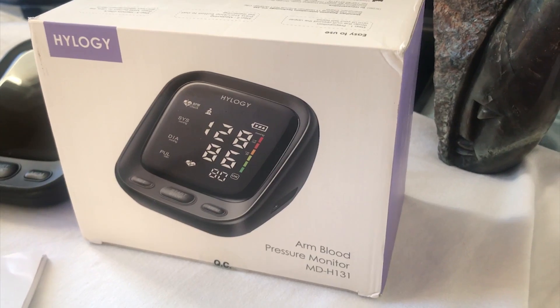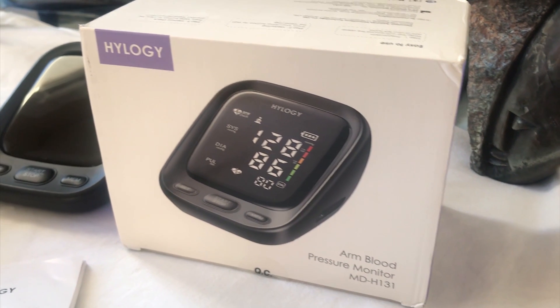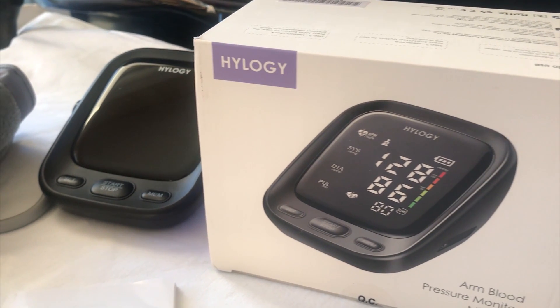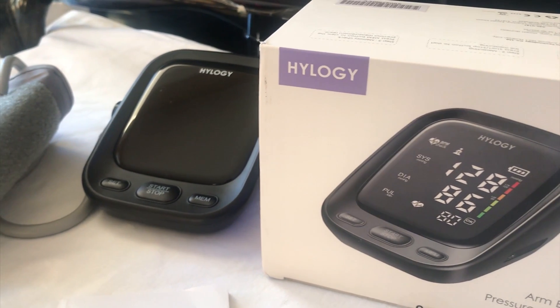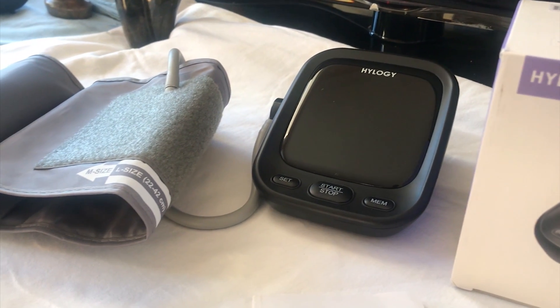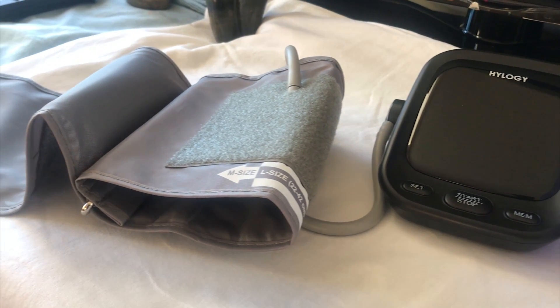The pressure cord is long enough that you can place the device on the desk and rest your arm without tugging the device itself. It comes highly recommended in my book. Once again, thanks to Hillogy for providing the product and for continuing to up the game in giving a product that's good and easy to use. This has been Victor on the Let Me Explain Show.